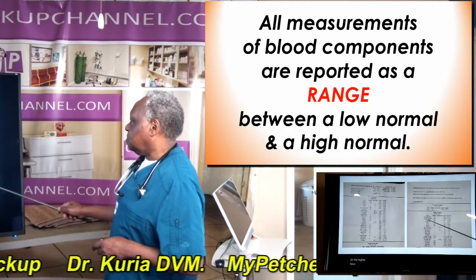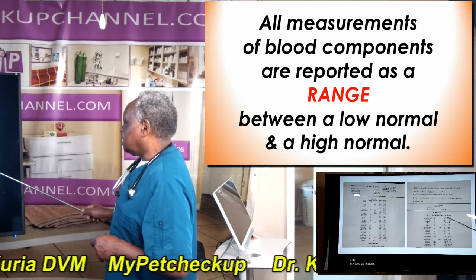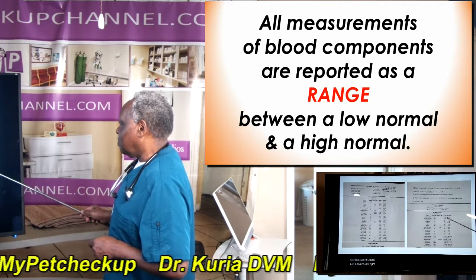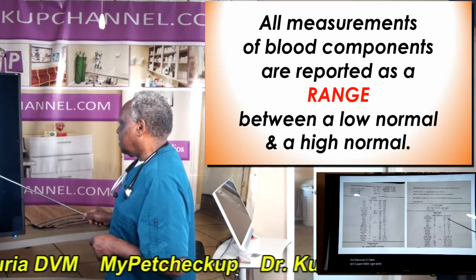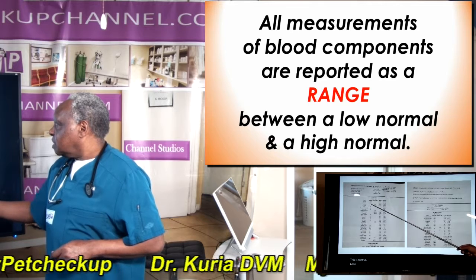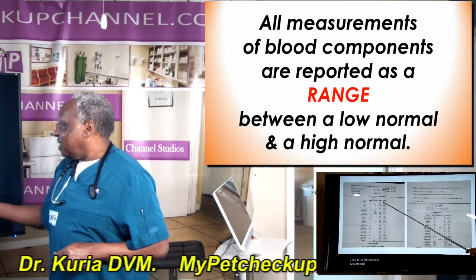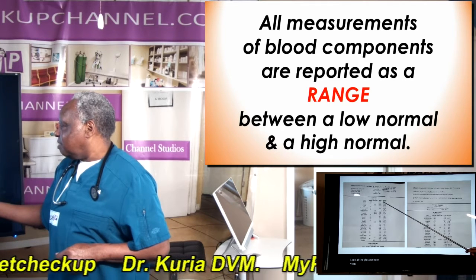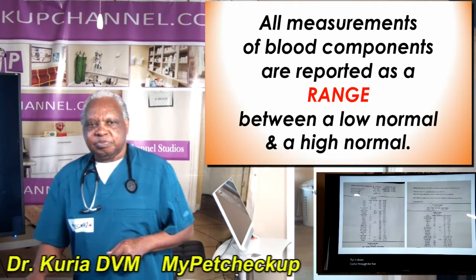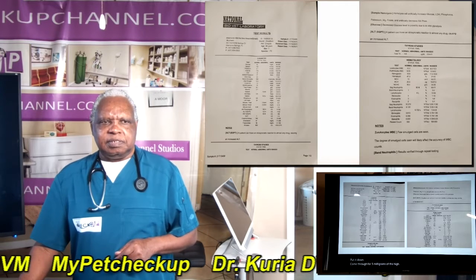If you look at leukocytes here, the range is between 6,000 and 13,500. 6,000 is the low normal, 13.5 is the high normal. Look at the glucose here, measured in milligrams per deciliter. The range is 77 milligrams per deciliter on the lower edge and 155 milligrams on the high normal.